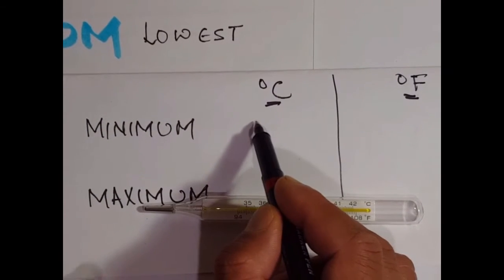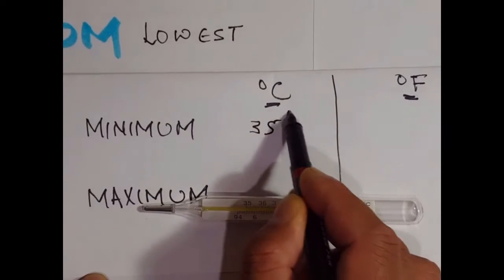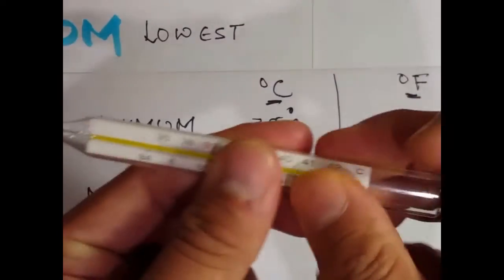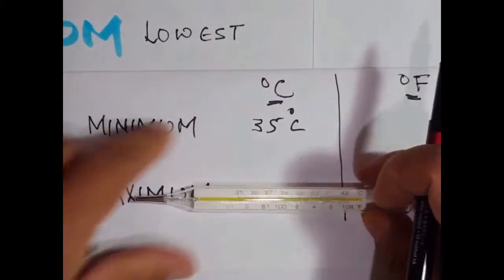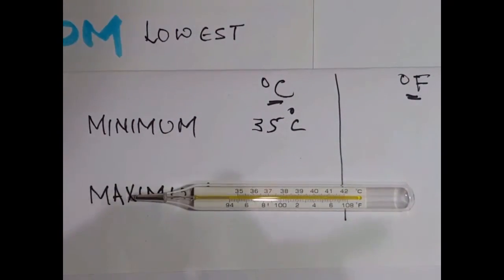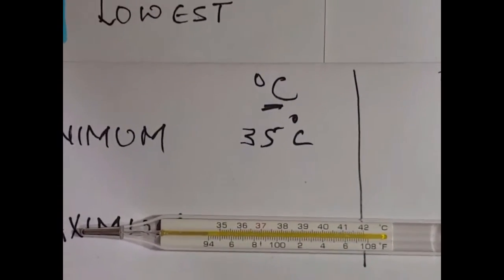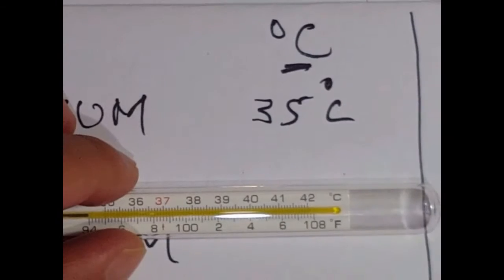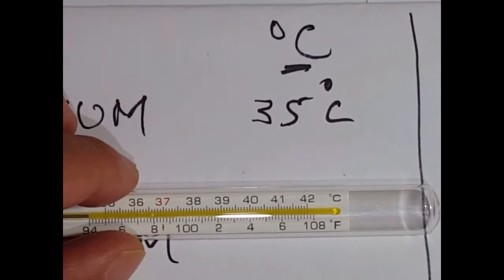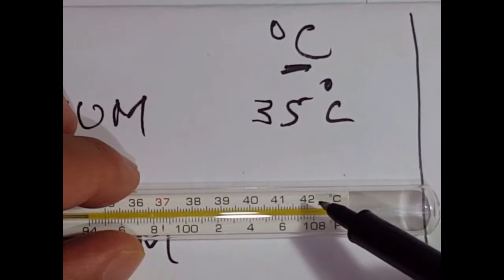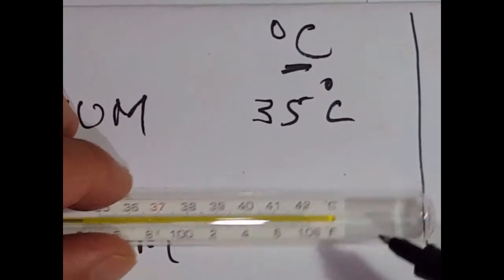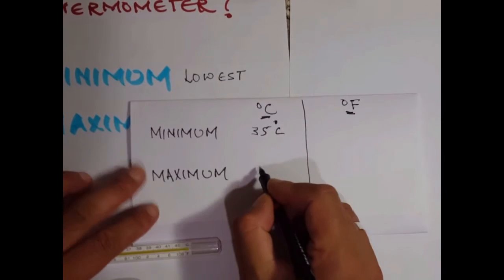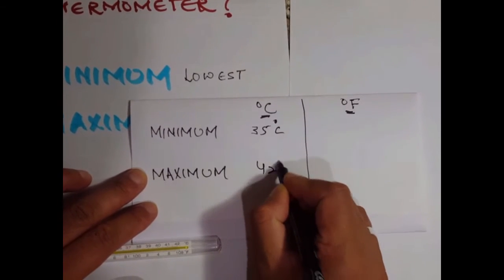So the minimum it can measure is 35 degrees Celsius. And what is the maximum temperature it can measure? Let me zoom in closer — here it is, 42 degrees Celsius. If you look carefully, it is 42 and the unit is degree Celsius. So the maximum temperature that this thermometer can measure in Celsius is 42 degrees Celsius.